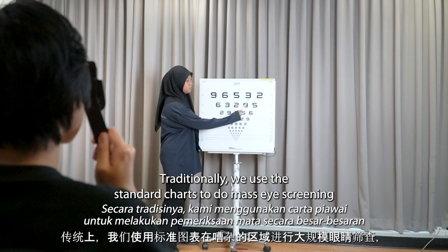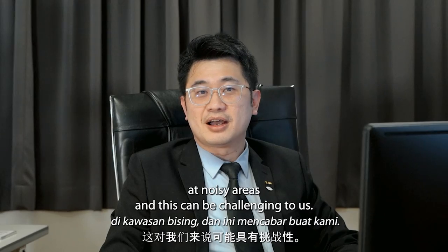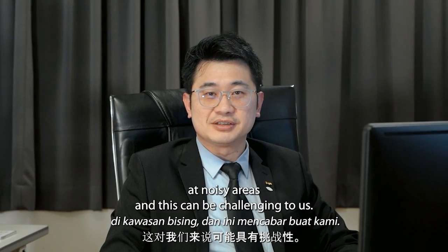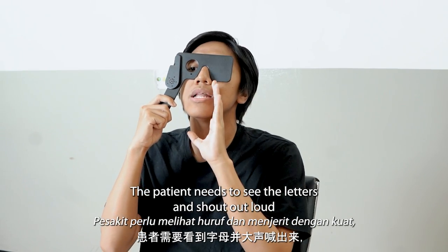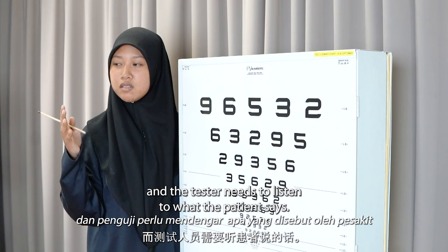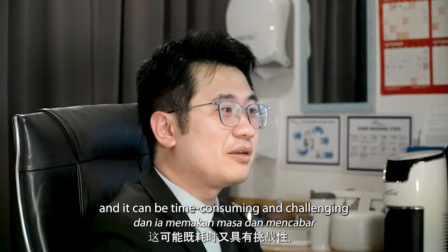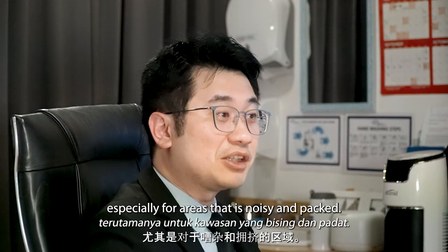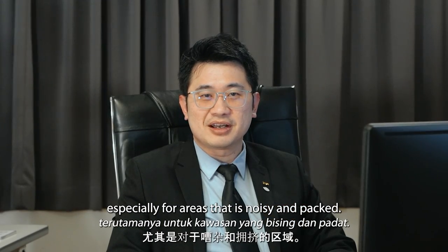Traditionally, we use standard charts to do mass eye screening at noisy areas, and this can be challenging. The patient needs to see the letters and shout out loud, and the tester needs to listen to what the patient says. Not everyone owns a Snellen chart and it can be time consuming and challenging, especially for areas that are noisy and packed.